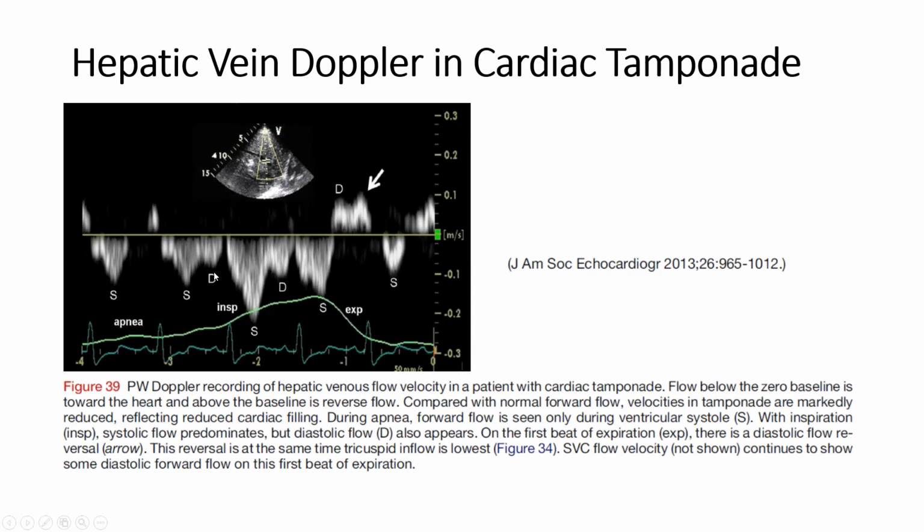Now, an easy way to wrap your head around this is that the diastolic velocities occur, as the name indicates, during diastole. So that's the time when blood flows from the great veins and hepatic vein into the right atrium and forward into the RV or LV, depending on which vein you're talking about. Tamponade is a condition that limits ventricular filling. So the diastolic velocities are low because diastole is impaired in tamponade, so that's why these velocities are low. What happens during expiration? Which ventricle gets to take the bigger cut of the volume that is available? Left ventricle. So the septum is actually now moving towards the right ventricle, which makes this problem of diastolic filling much worse, causing the diastolic flow signal to reverse, okay?